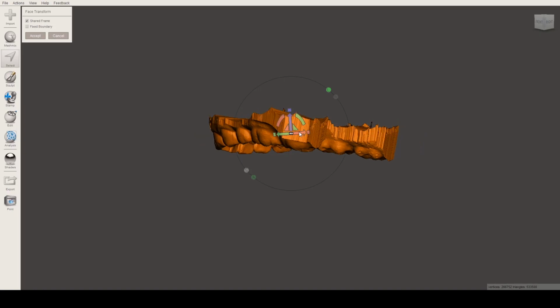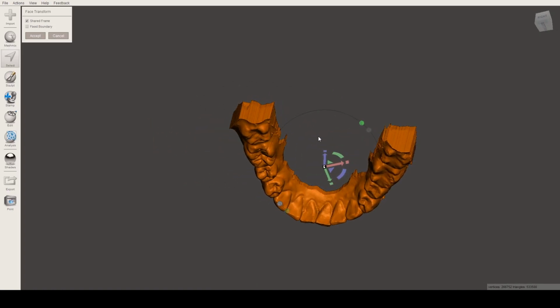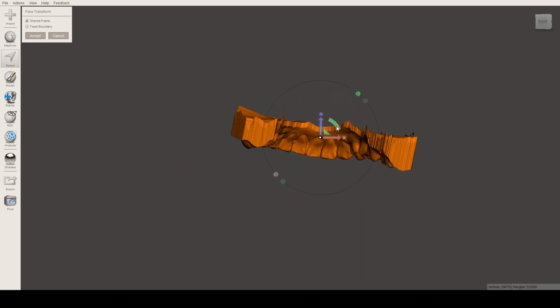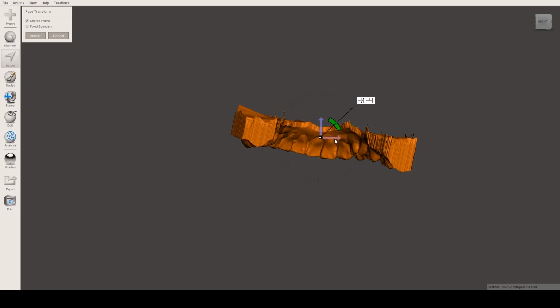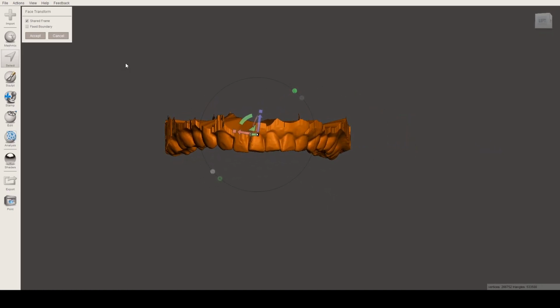More. I think that's too much. Is it too much? Okay, not yet too much. It's still okay. Where can we turn this around? Oh, it's a little skewed. I hope I didn't put it too much. Oh, that's too much. Just a little. A bit more. There you go. So now we have that as our model.